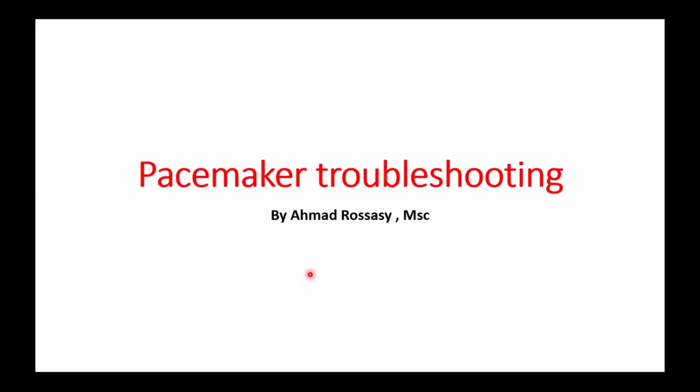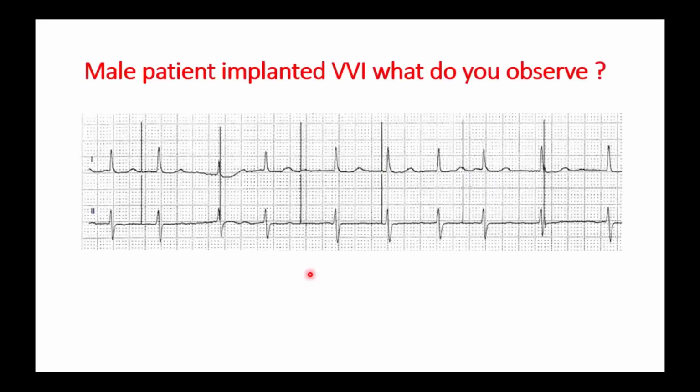Today we're going to talk about pacemaker troubleshooting, and we're going to present this lecture as multiple case scenarios and trace how we should deal with these cases.